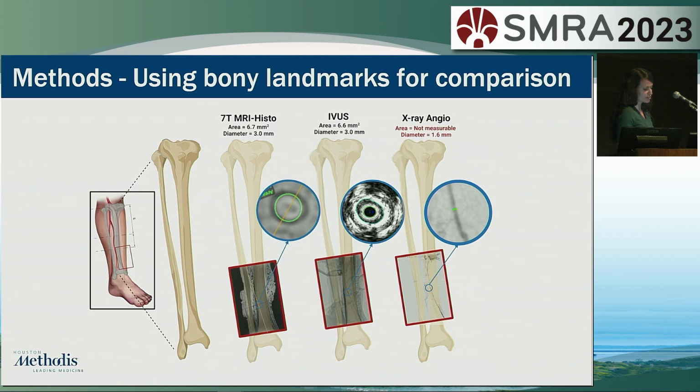For the initial registration, we used manual alignment of these 2D and 3D X-ray and MRI images. And for enhanced accuracy, we also used the aforementioned curved multiplanar reconstructions of the treated vessels.